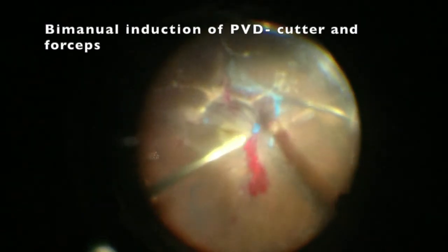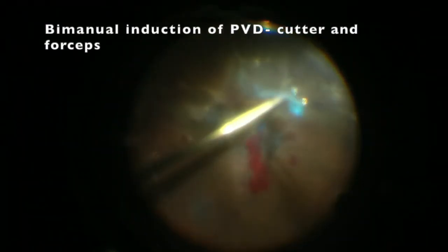So this will help to gently dissect the posterior hyaloid away from the detached retina. So you can see slowly everything comes off very gently. So that is one of the ways of doing it.